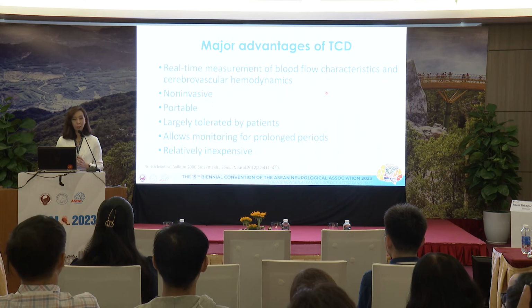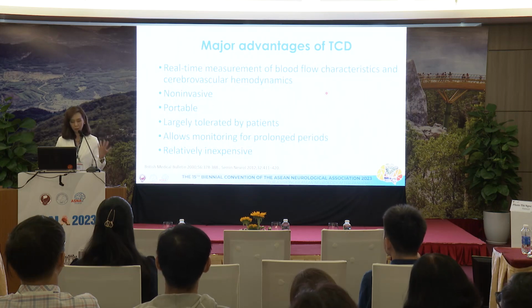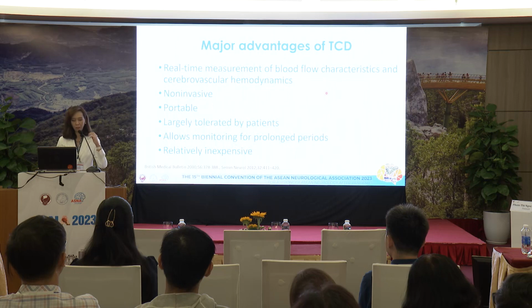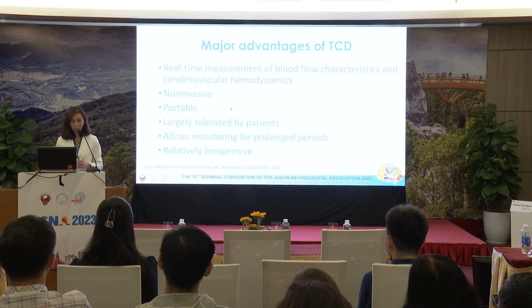So there are advantages of TCD compared to some other techniques that we use to diagnose stenosis of the blood vessel. It can be done in real time. You can measure the blood flow in real time, so you know exactly how much blood flow is going in, the velocity of blood flow, and the direction of blood flow at the very moment. It's of course non-invasive. We're not using any harmful things, and it's portable, as mentioned earlier.